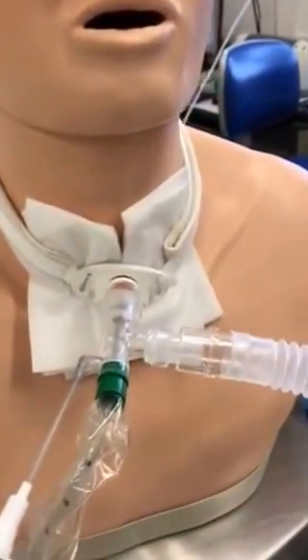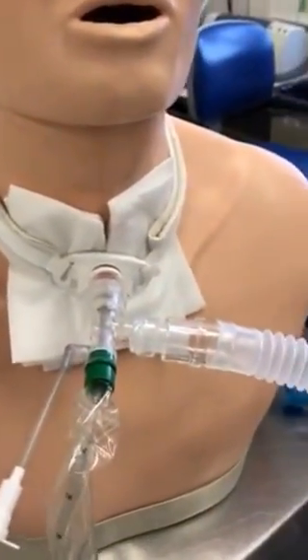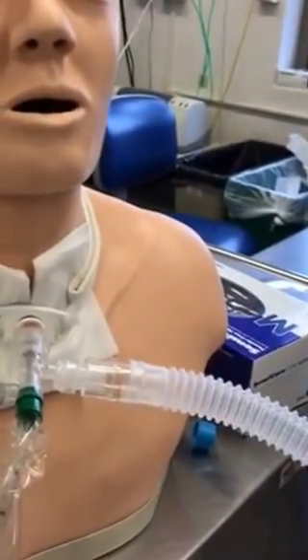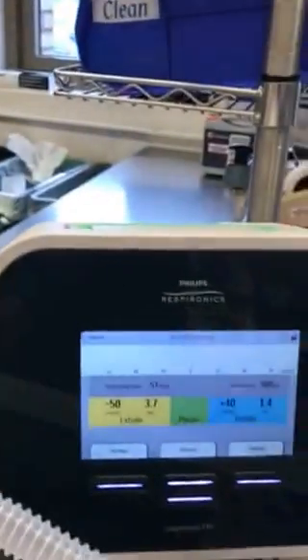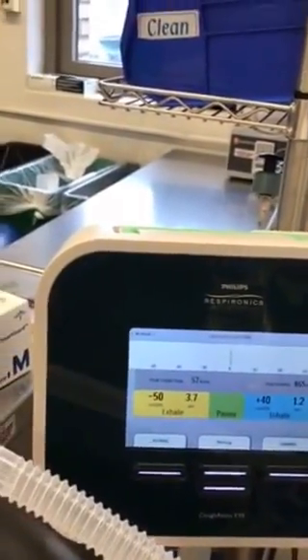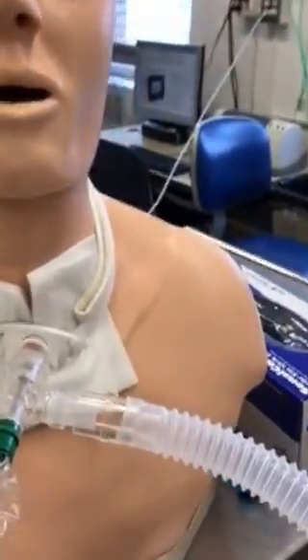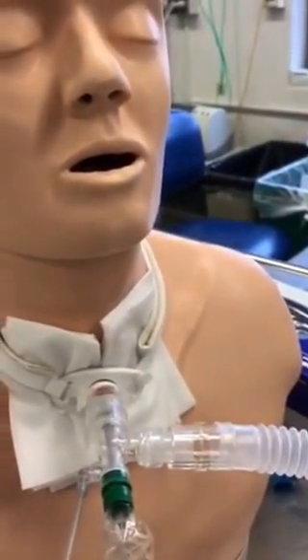It's very important that you suction while you're doing that, because if not, it's just gonna come up all the way and it can clog up your tubing. Watch the patient, make sure they look fine, look at their sats and their heart rate, and then give them time to rest, because sometimes it could be very hard for them to adjust to this. Give them intermittent breaths in between, and start up again. You're going to repeat it until secretions are lessened or there are no more secretions left.